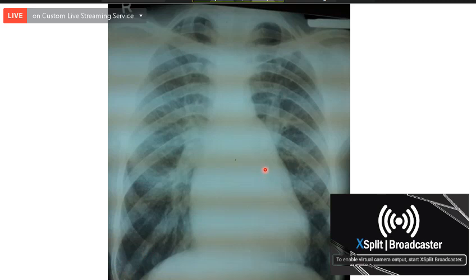How do you diagnose peribronchial cuffing? There will be a dark central air shadow, and around the central shadow there will be a whitish shadow. So here you can see peribronchial cuffing, very well seen here. Can you see here? Yes, sir.